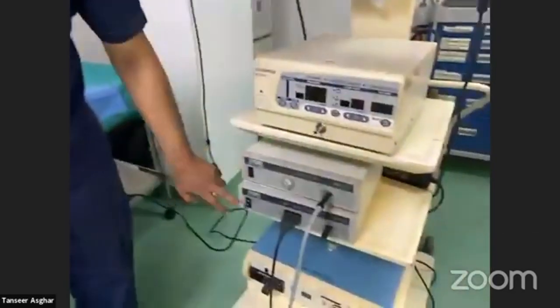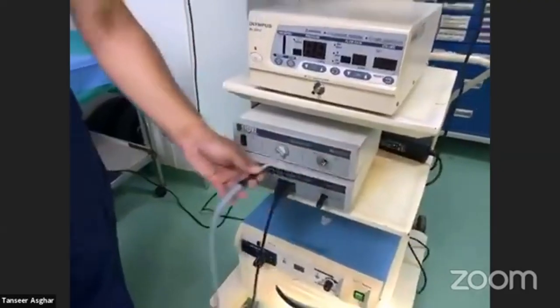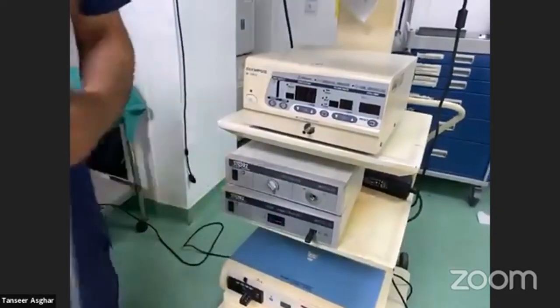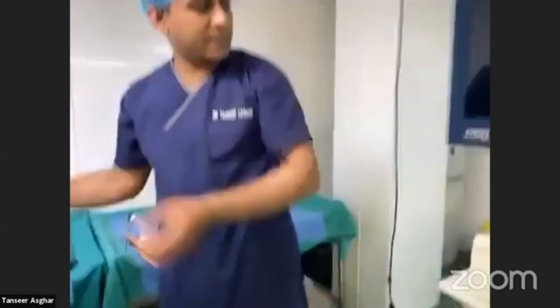At the end of the procedure, you gently detach all the components so they are properly secured. That was the overview of the lap stack.